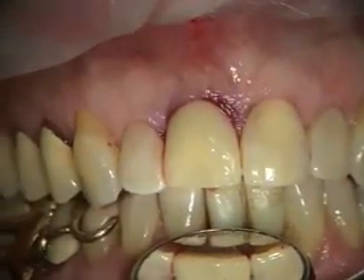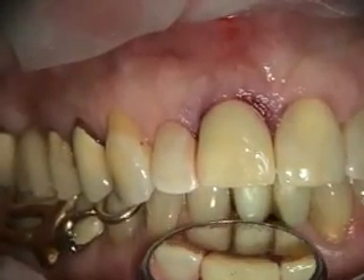She's got good occlusions. Bite again — no occlusion issues.